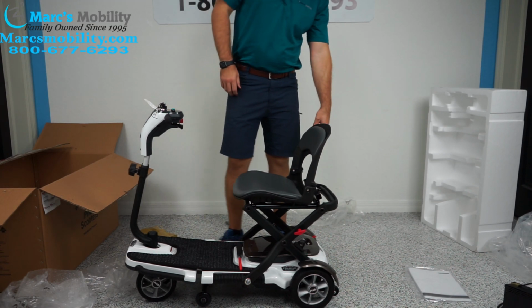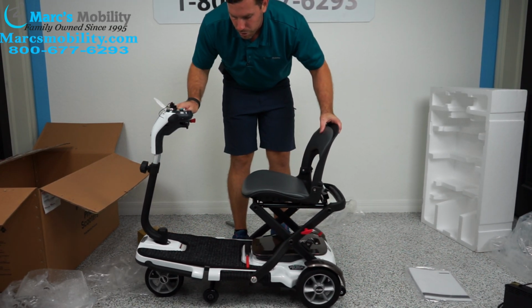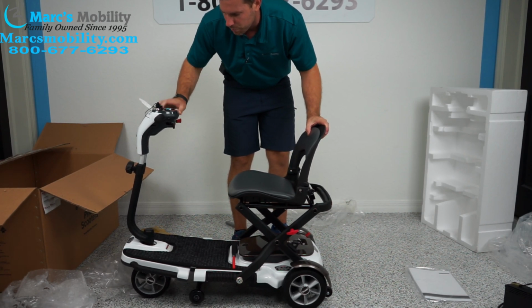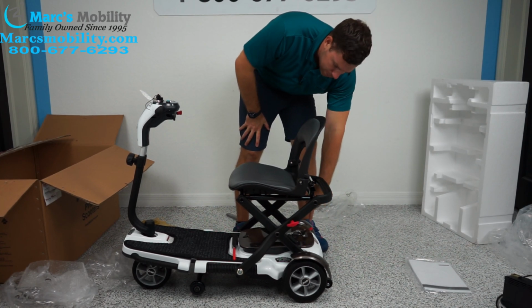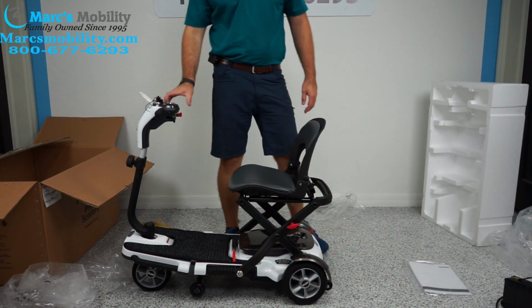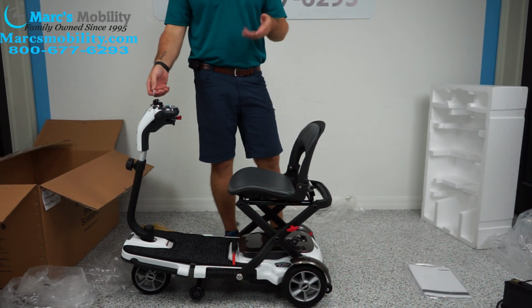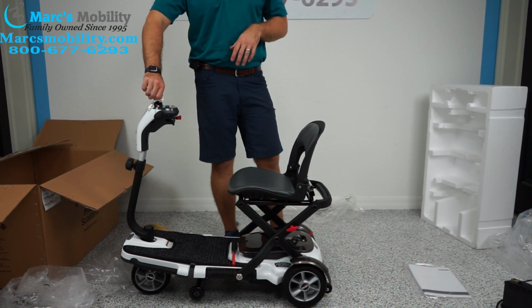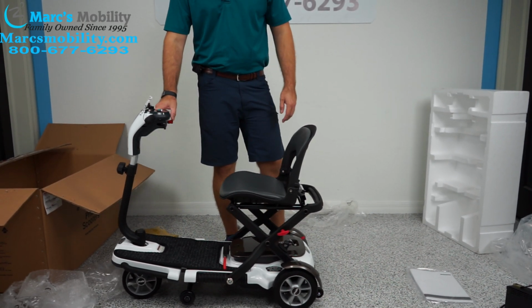Now you do want to make sure that you are in gear. If you're not in gear and you're in freewheel, the unit will roll around, but you'll see it will not move, and you'll get a flashing symbol over here with your power. So make sure you are in gear, which is with a D, the drive, with the lock symbol on it. Anytime you then go to turn your unit from neutral into gear, you have to reset the unit. So turn the power off, turn it back on, and then you'll see your power light will steady out, and then you're ready to go.